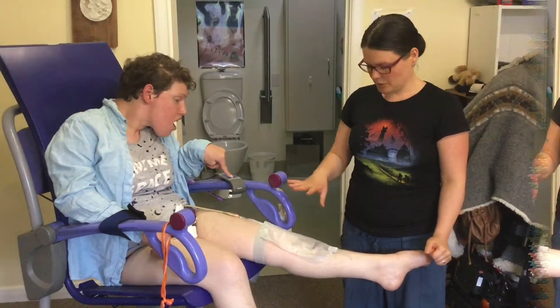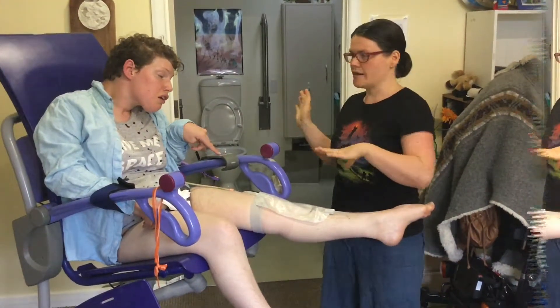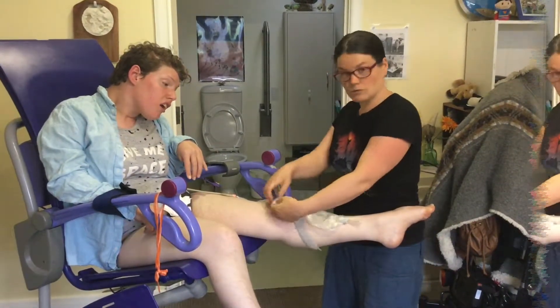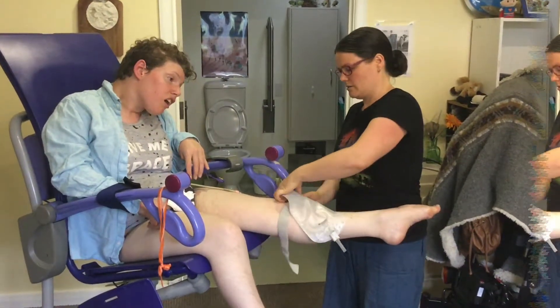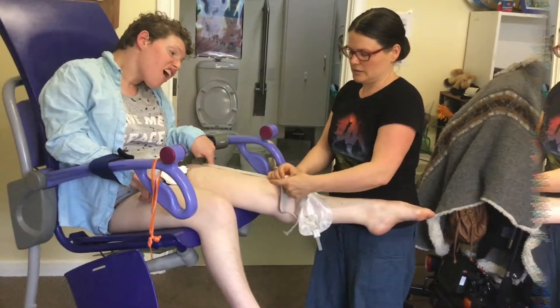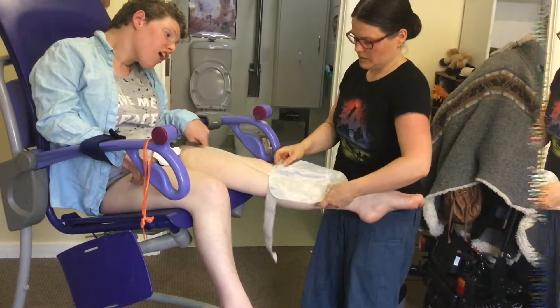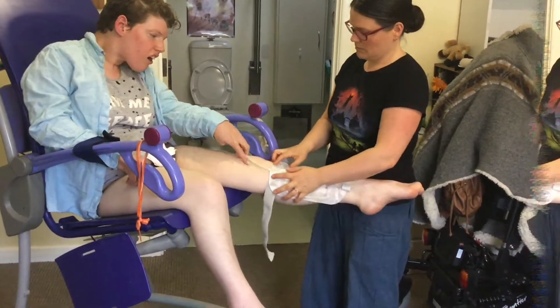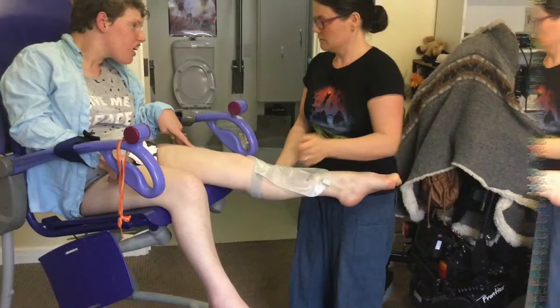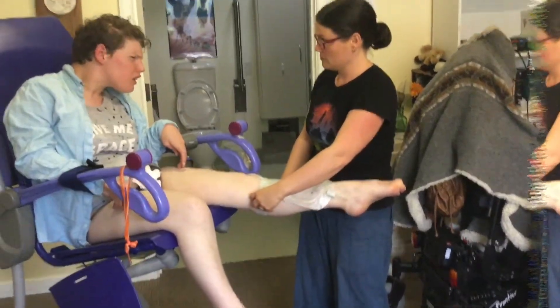This video is about getting Sam's leg bag ready for the day. She's had her shower and is all dry, so the first thing to do is replace the strap because it'll be wet. We've got a new leg strap that buttons into the top of the bag. Position it there, do that up, and Sam will let you know how tight she wants it — good, that's in the right position.